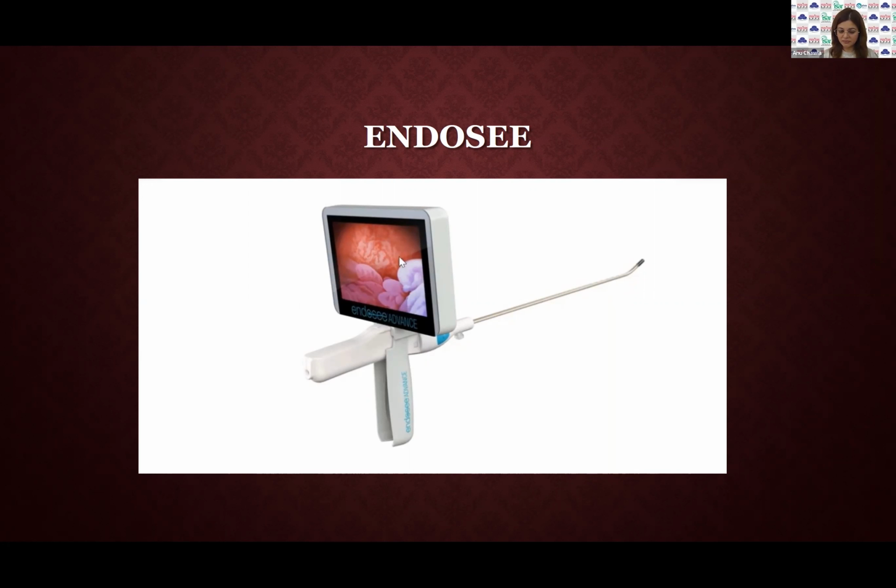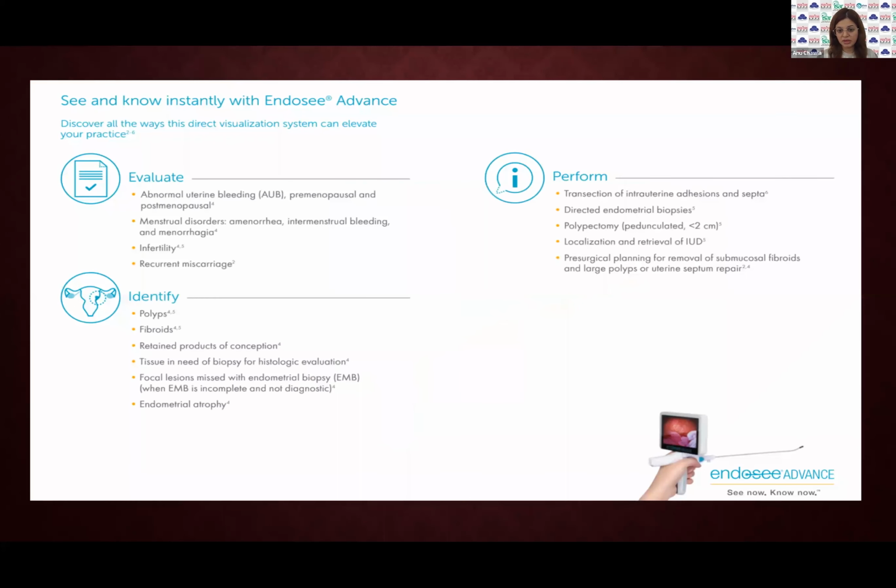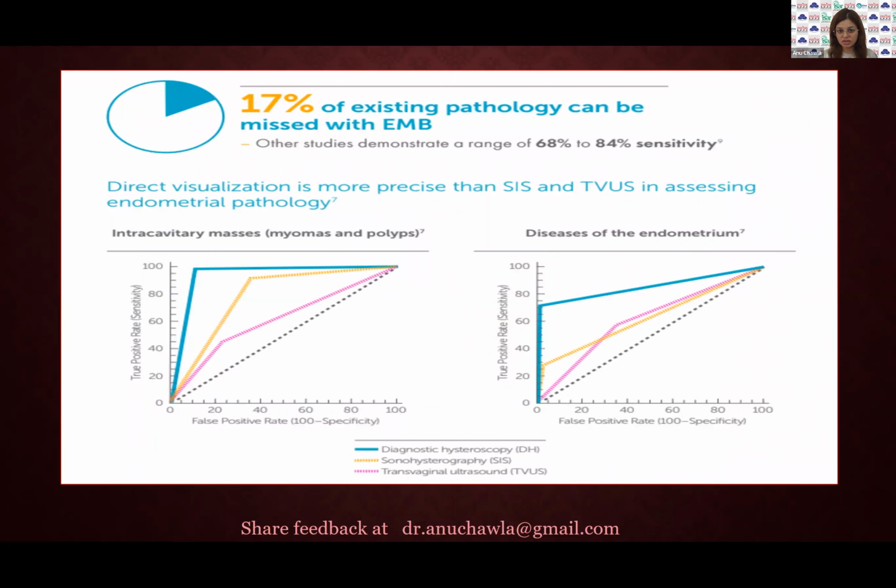But after many years, when someone actually goes in the uterus, there's a polyp sitting, or there's some pathology which was not seen, because at the end of the day, a proper hysteroscopy is actually a surgery. People don't accept surgeries very easily, not all of them. So something which is less invasive, easy, even cheaper, will definitely allow them to make use of such technology.